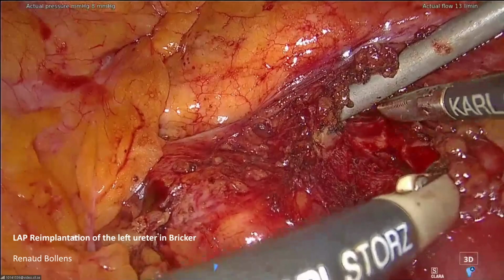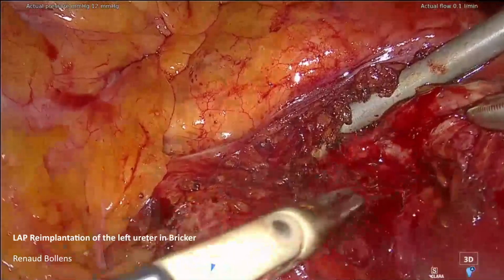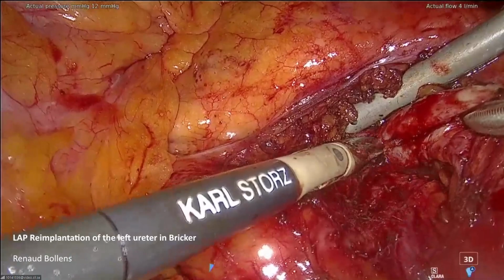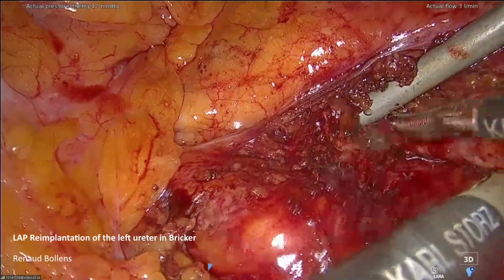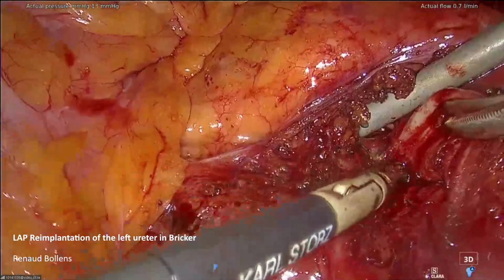But at the same time, you risk to mobilize also the distal portion of the right ureter. Yeah, but they are implanted normally, they told me, in a separate manner. And normally the risk is very low. And of course, here normally I will not use this part of the ureter. If I continue to dissect, it's just to remove for carcinological reasons, not to use later. Then I can stay really close to the ureter. But I don't know if it will be possible really to remove this fibrotic tissue.